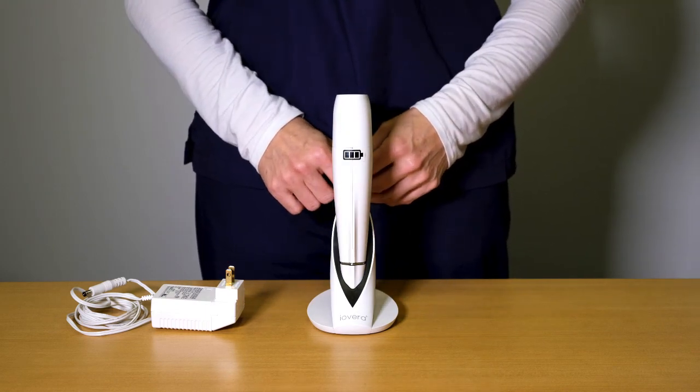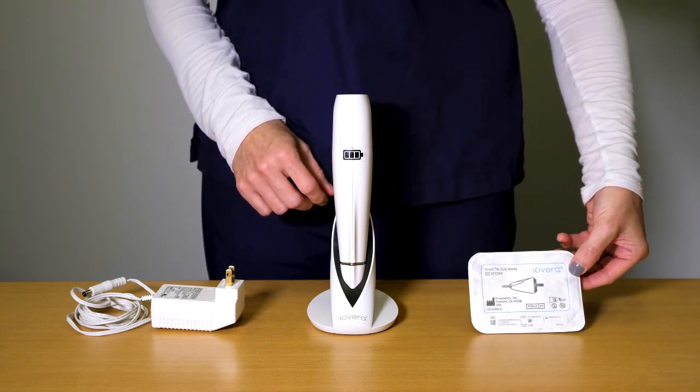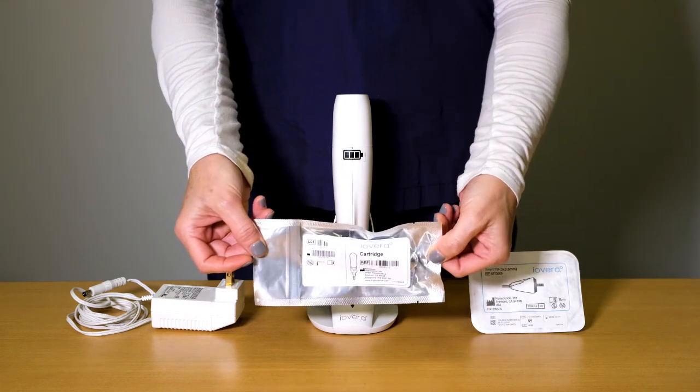To perform an iOVERA treatment, you will require one iOVERA smart tip needle and iOVERA nitrous oxide cartridges, both of which are shipped separately.